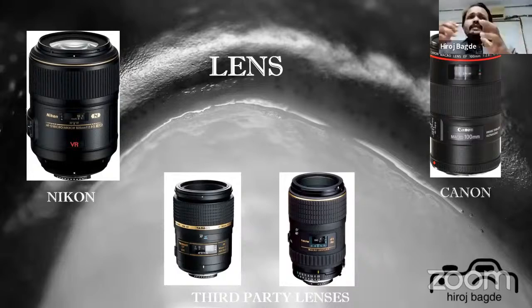Okay, so that's why different third-party lenses have created different kinds of macro lenses ranging from 85 mm to 105 mm. Nikon has 105, Canon has 100 mm. Now they also have f2.8. What I told you in the previous slide is that it is just the amount of aperture which the lens can allow. So we need to standardize that also. That's why we consider a range up to f2.8 as apt for the amount of light that should be entering for the particular image.